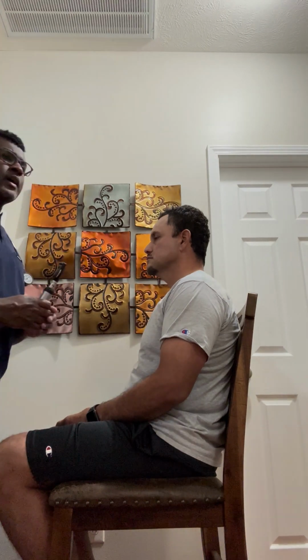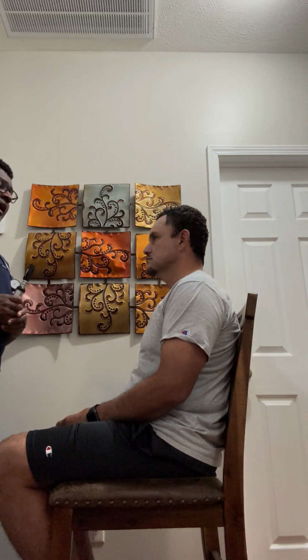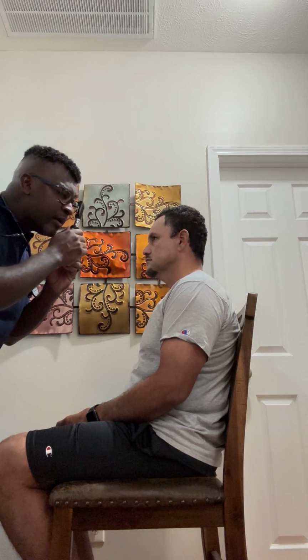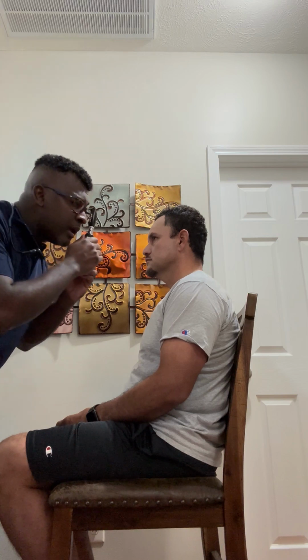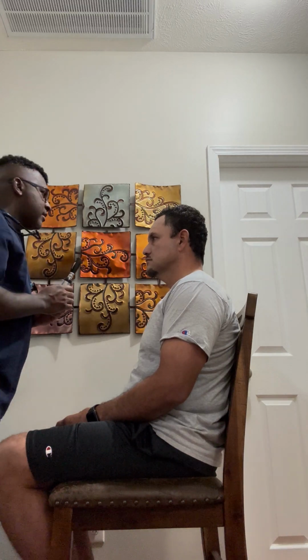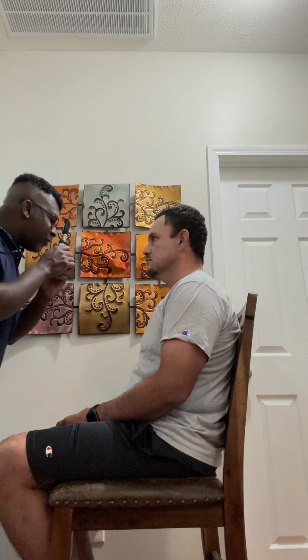And then I'm going to move into testing for the direct and consensual response. So when I'm doing that, I'm going to examine his right eye. I'm going to step back and look until I find it. I'm going to start with the left eye. Left eye there. I'm going to move in, examine the eye, and get the red response. Okay. And then I would do the same with the opposite eye. I would do the left eye, and then I would do the right eye.